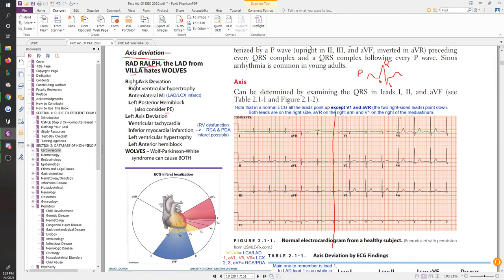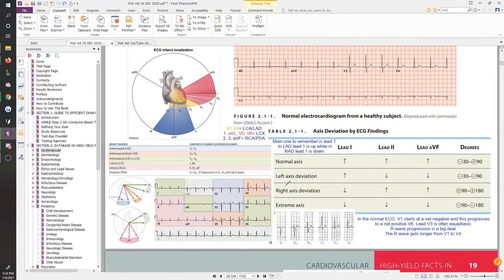Is it a right ventricular hypertrophy? Is it an anterolateral MI? Is it a PE? You'd have to do more management, more evaluations, more tests need to be ordered, right? And that's kind of what your CK exam is all about, which test you should order next. And that's something that you have to get really good at because although on the surface it seems like a pretty simple question, you know, what test should you order next?